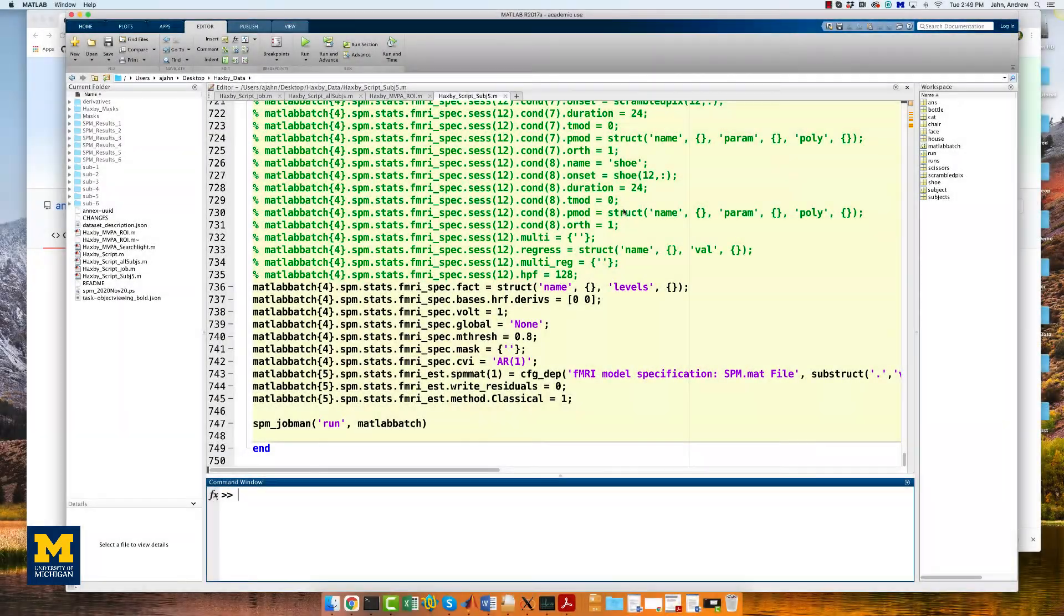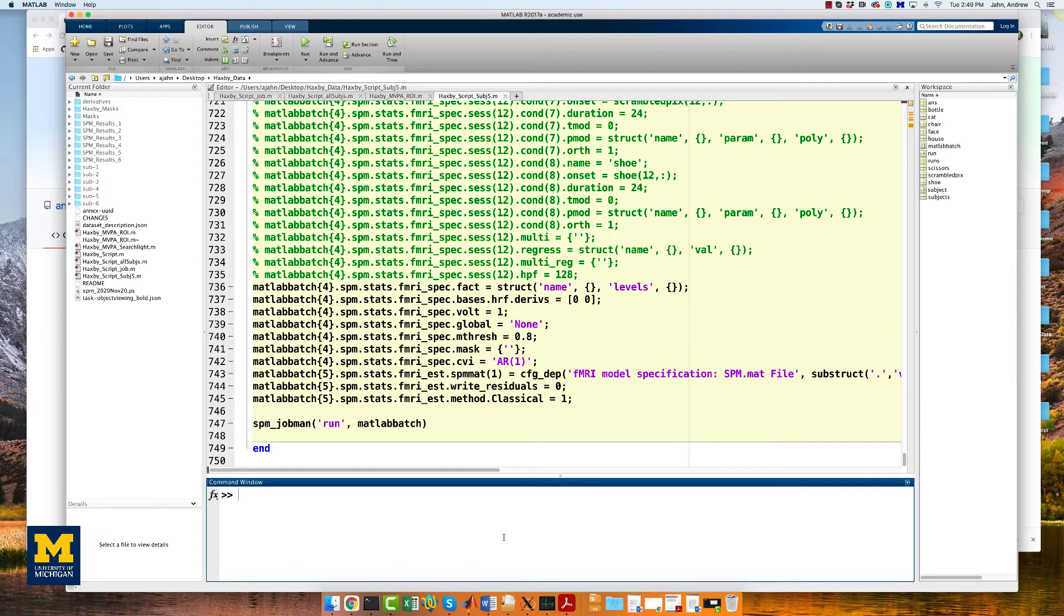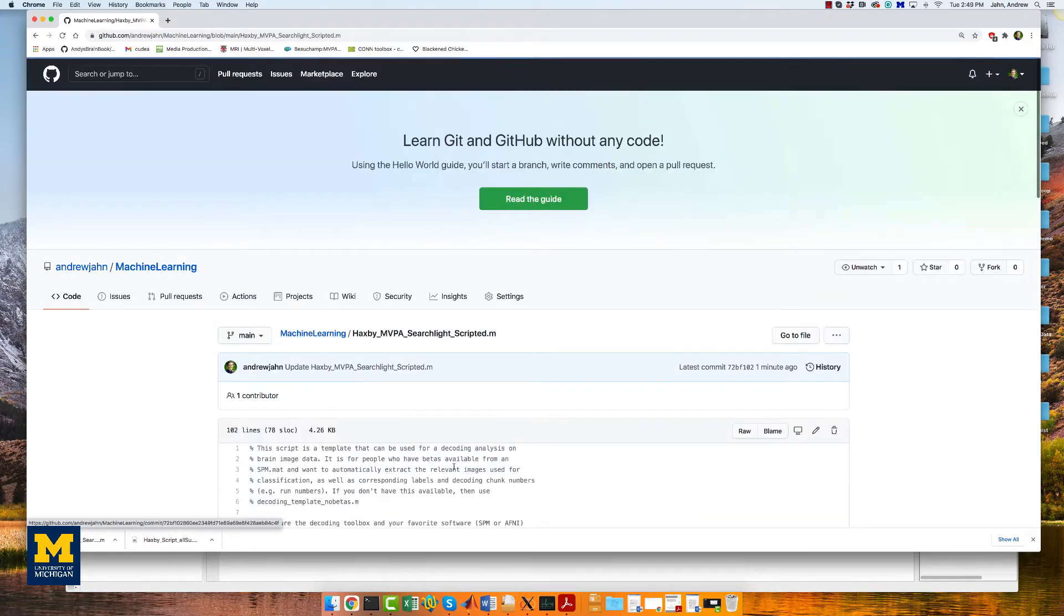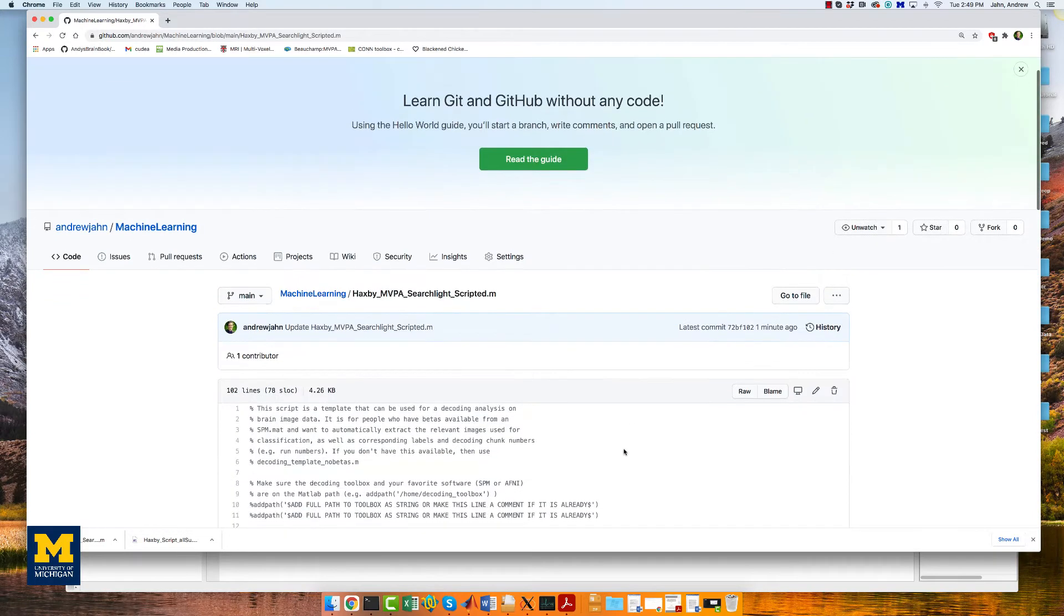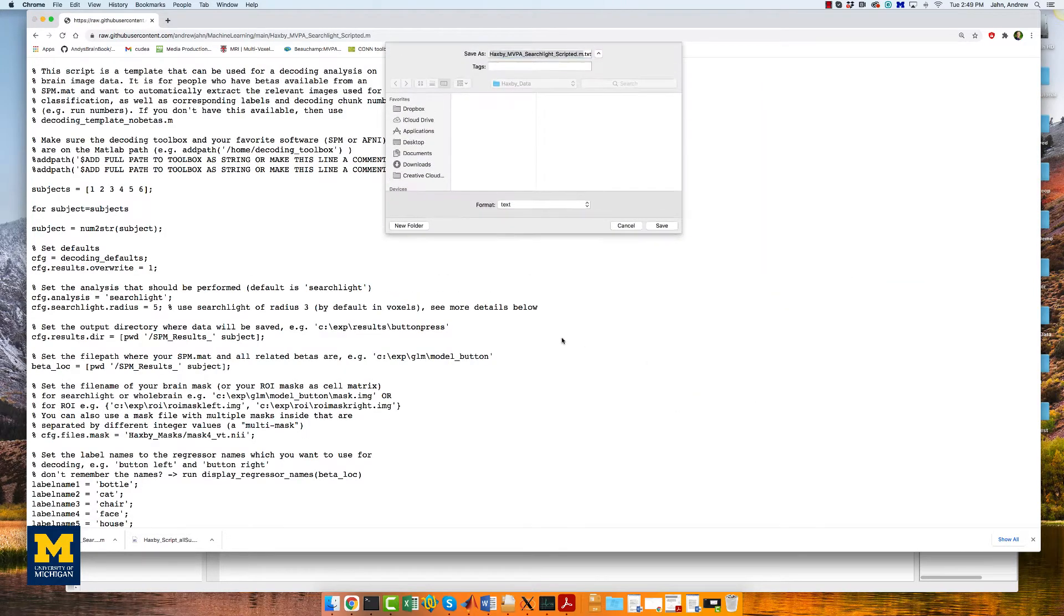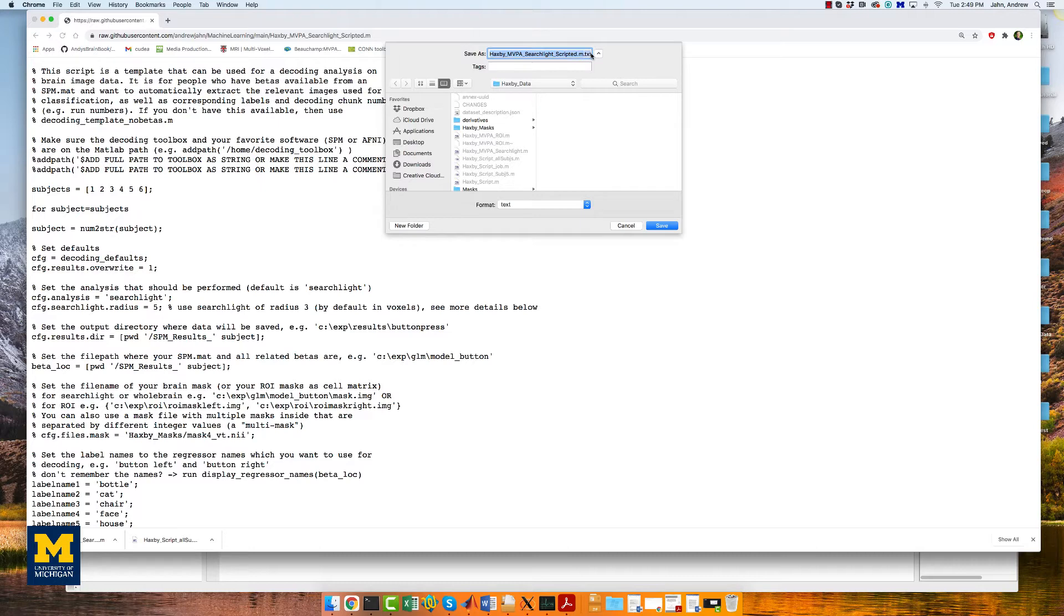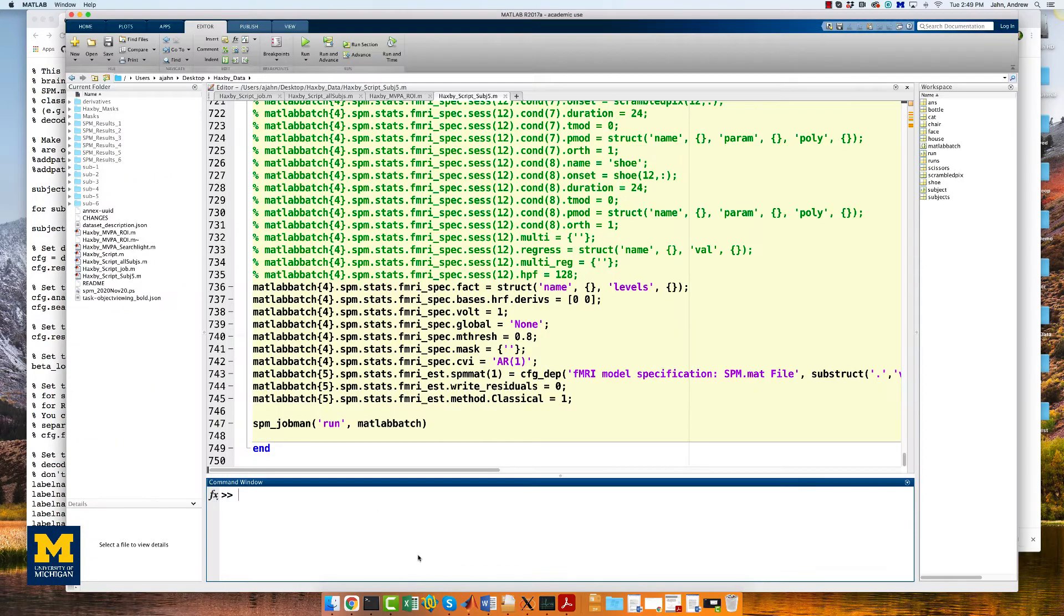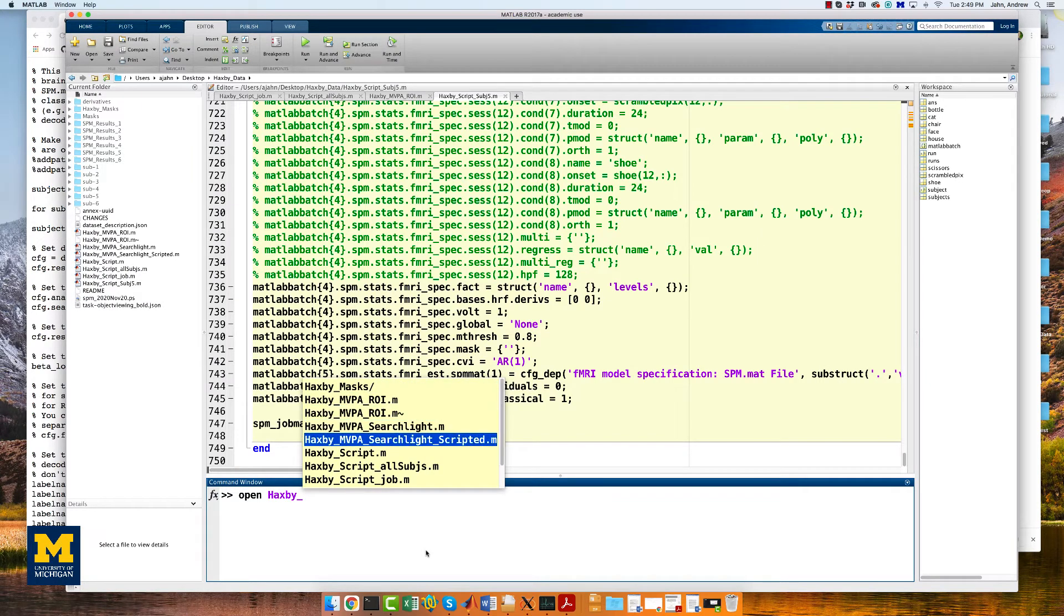Once we've pre-processed all of the subjects, we can do our MVPA analyses. The edits we do to these scripts are going to be very similar to what we just did for the pre-processing scripts. And we have some scripts already made for you on the GitHub page. Go ahead and download the file Haxby MVPA Searchlight scripted and open it in the MATLAB terminal.